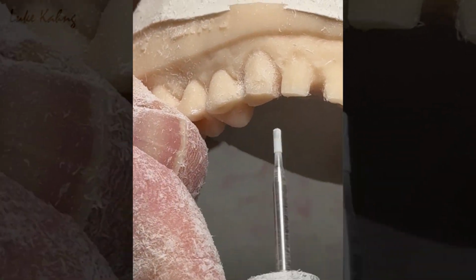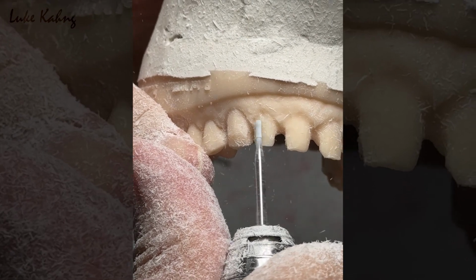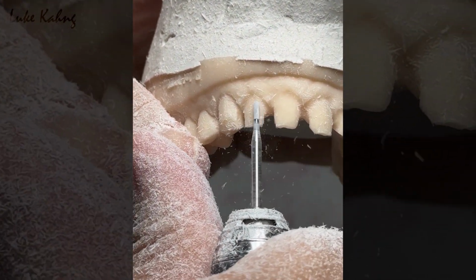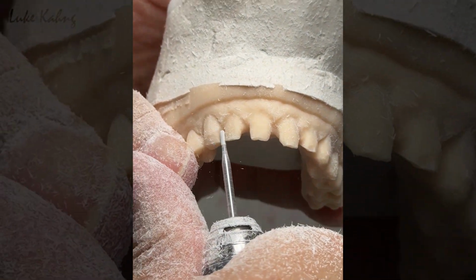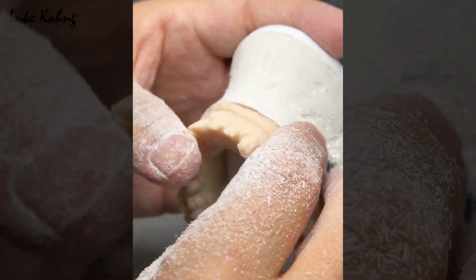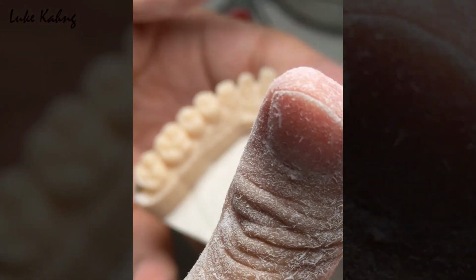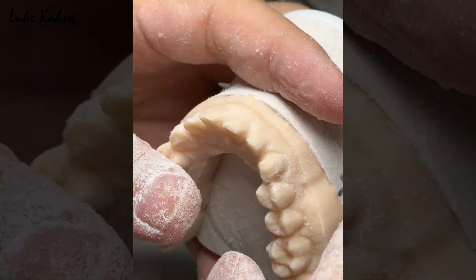That's good. Don't like this. Alright, so 1, good. Get rid of the undercut, back and forth, so I can make good symmetry in between the teeth. After I check the bite, then I want to see the room here, room there. If I need more, then I have to grind it.